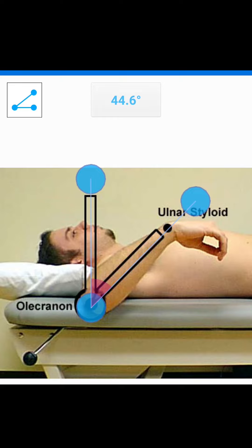So this one worked out. This is why I don't like it — because sometimes it's going to work out, and sometimes it's not going to work out. For this one, it's important to think about where am I starting and where am I finishing, and aligning the protractor at that starting range of motion and then the second measurement with the end range of motion. I hope this is clear for you.